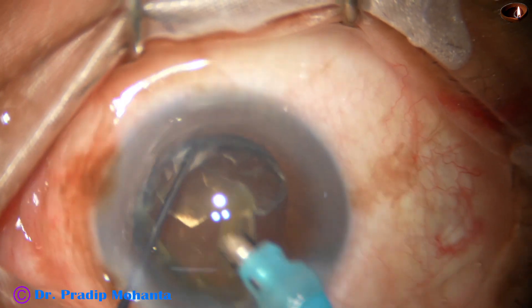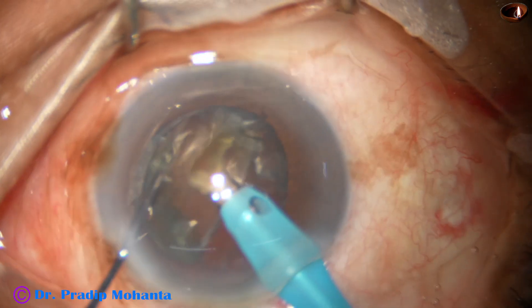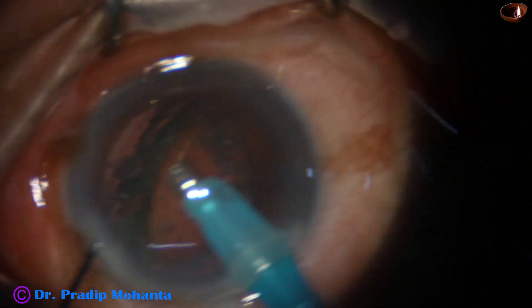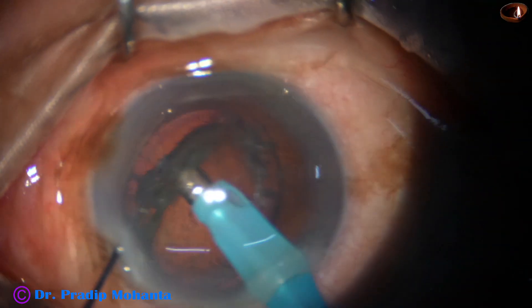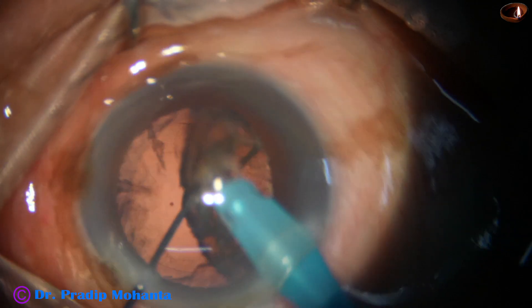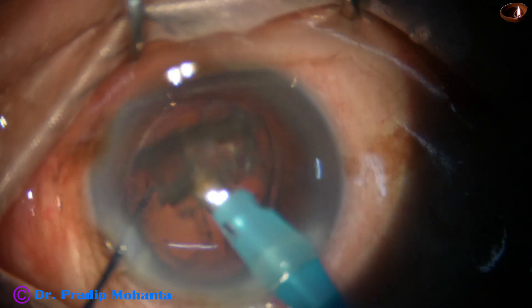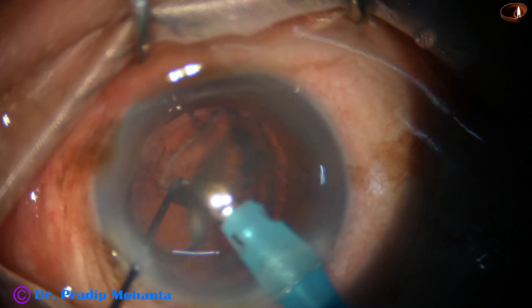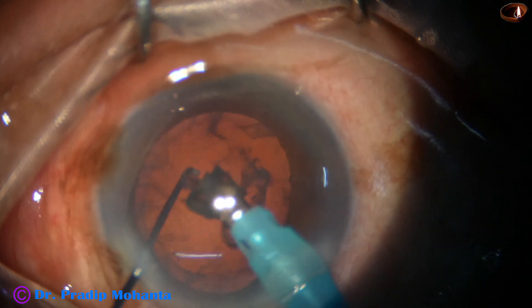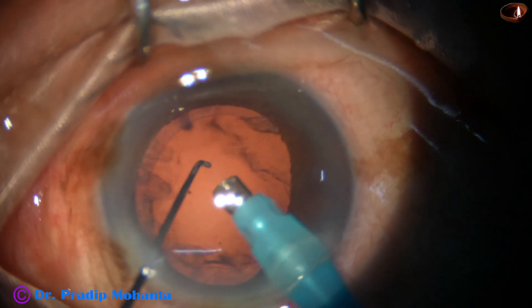Let us see the epinucleus shell. Yes, this is the epinucleus shell — it has protected the posterior capsule until now. Now we have to remove this. With low ultrasonic energy, low flow rate, and low vacuum, we can remove it safely, keeping the FACO needle at the center of the anterior chamber at the iris plane.